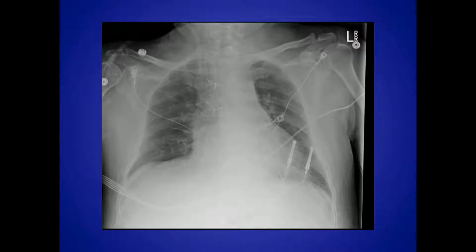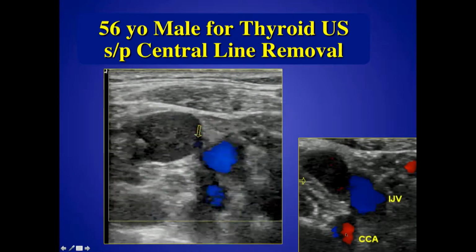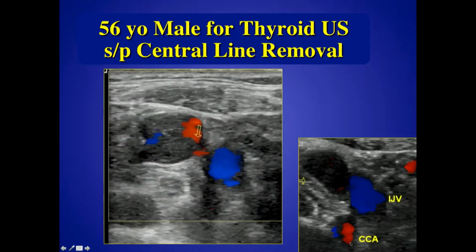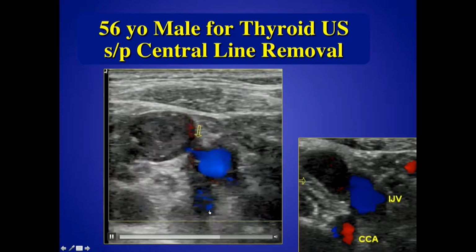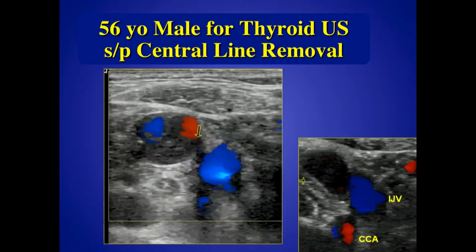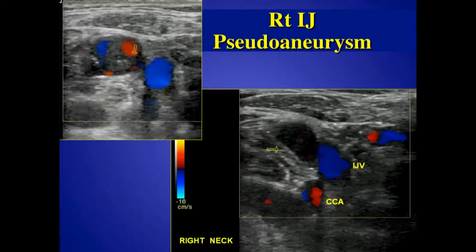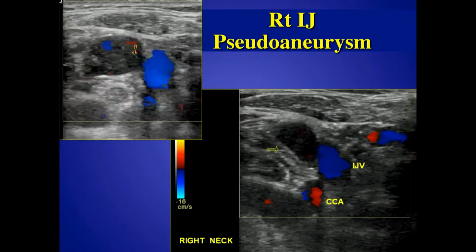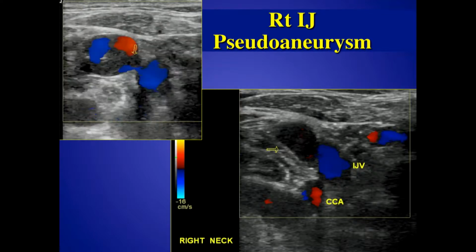So the diagnosis? Fistula? So it's a fistula between what? Well, the carotid's down here. The carotid is separate from the swirling. This is the carotid. This is a pseudoaneurysm from the jugular vein. The carotid's not involved. This is a hole in the jugular, which blood is escaping.